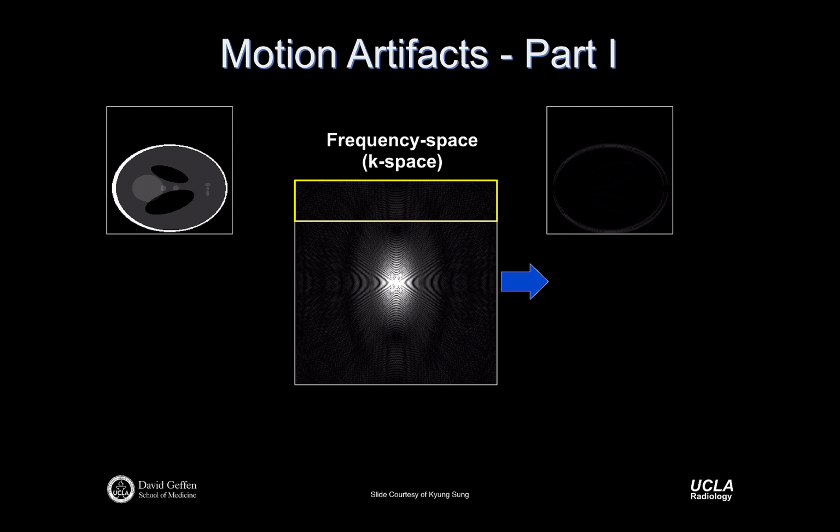Right, and so this is, I'm going to turn this down at least for a little bit. And so this is just making the point again that with the object in this position within the field of view, maybe this is the k-space that I acquired, and the 2D FT of that k-space is kind of this silhouette. It was one of the artifactual sort of features that you saw in the combined image.